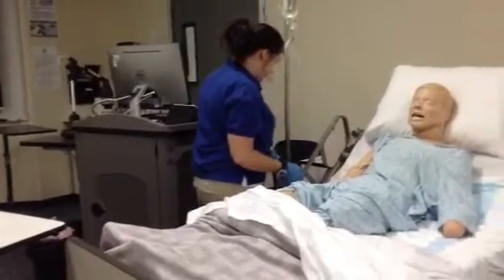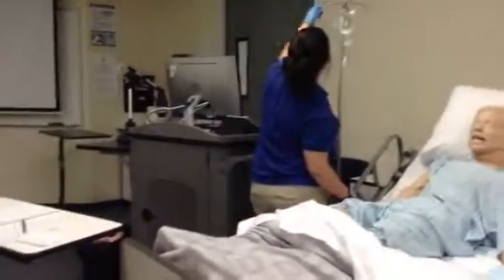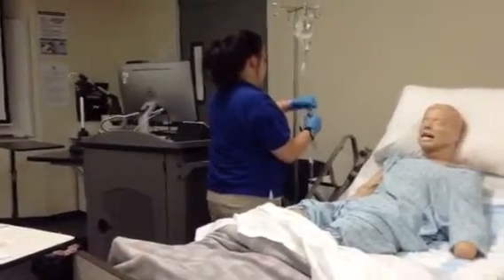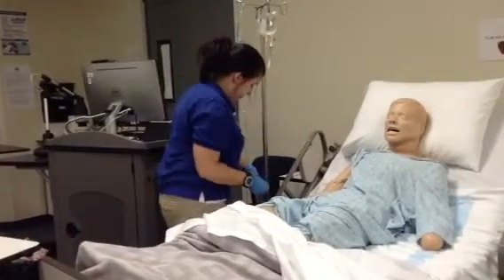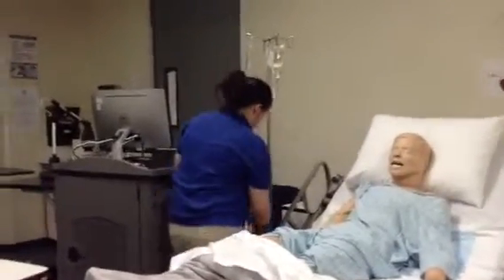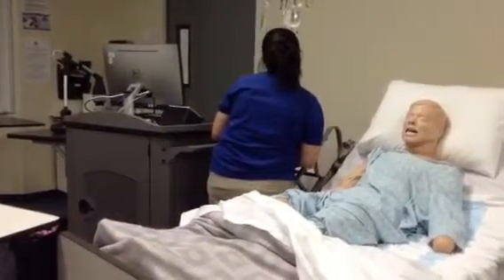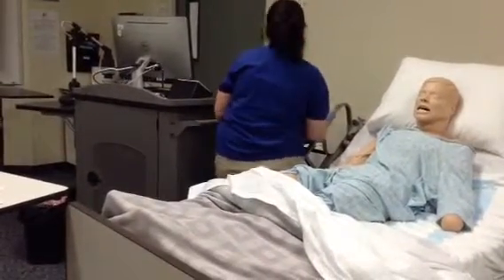If anybody had to give another secondary or anything like that. Go ahead and take this off. Okay, and hang this back up where it goes, hanging just as a primary with no piggyback. And we tolerated that medication well, so that's good. Okay, and check my drops per minute and my unclamping. Okay. And we still have 17 drops per minute, so that's great.